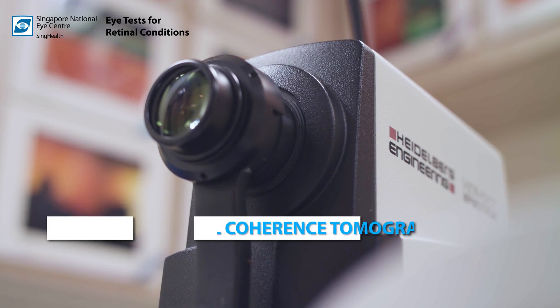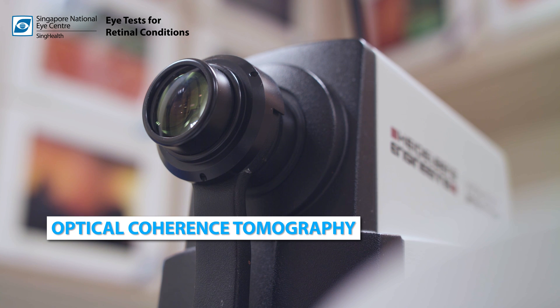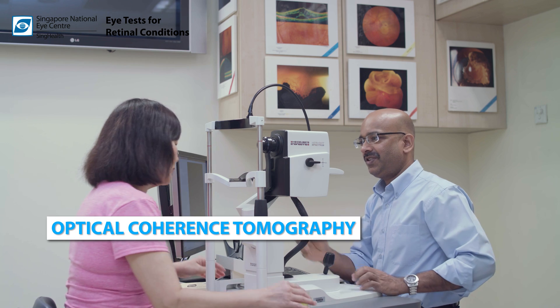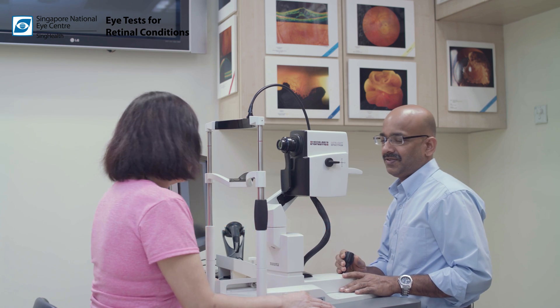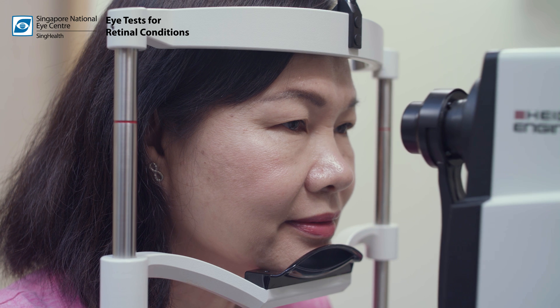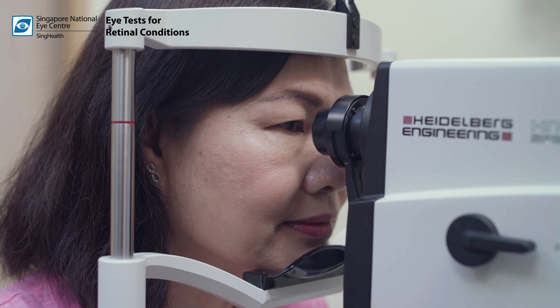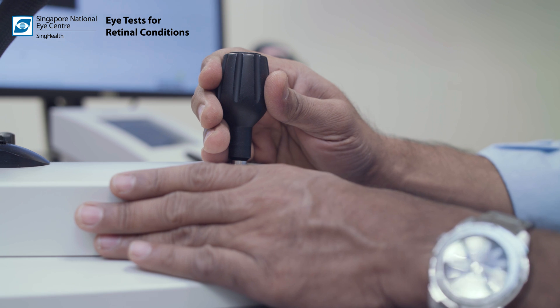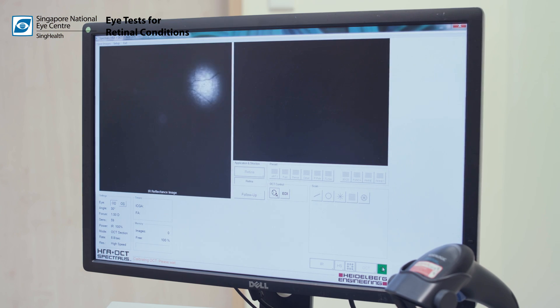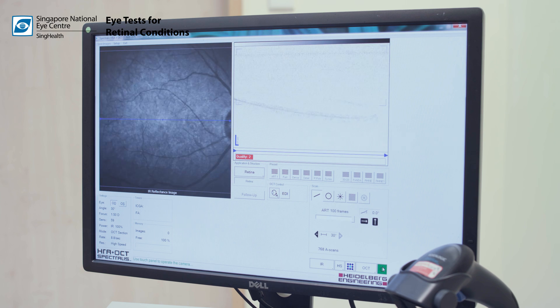Optical coherence tomography or OCT is a computerized imaging technique that uses laser light to take a cross-sectional image of the retina. The patient's pupils will be dilated before the test, after which an array of light is used to rapidly scan the eye. These scans are used to create an image of tissue layers within the retina.